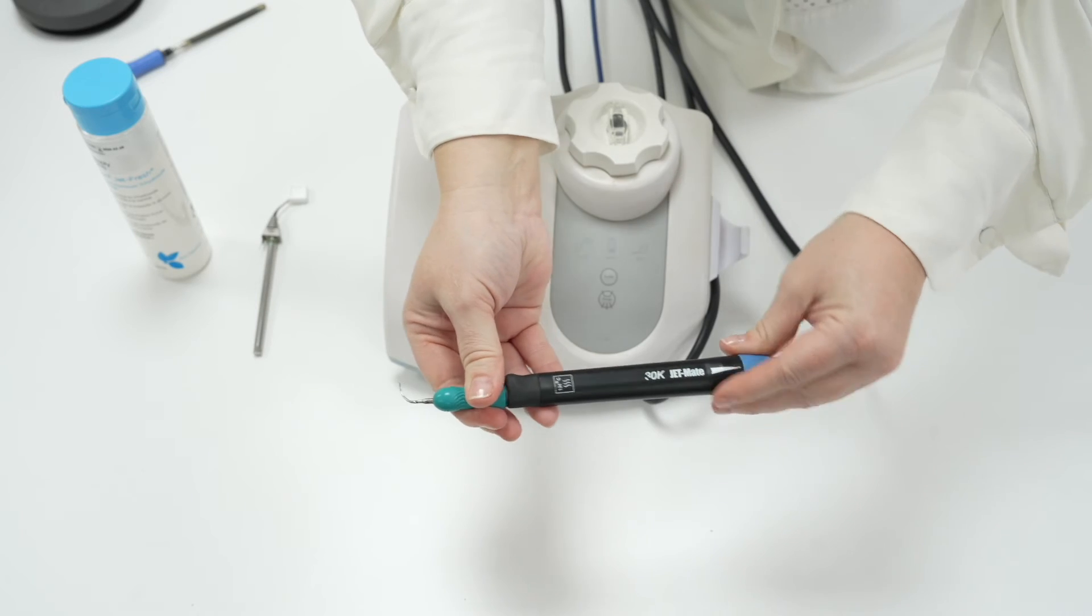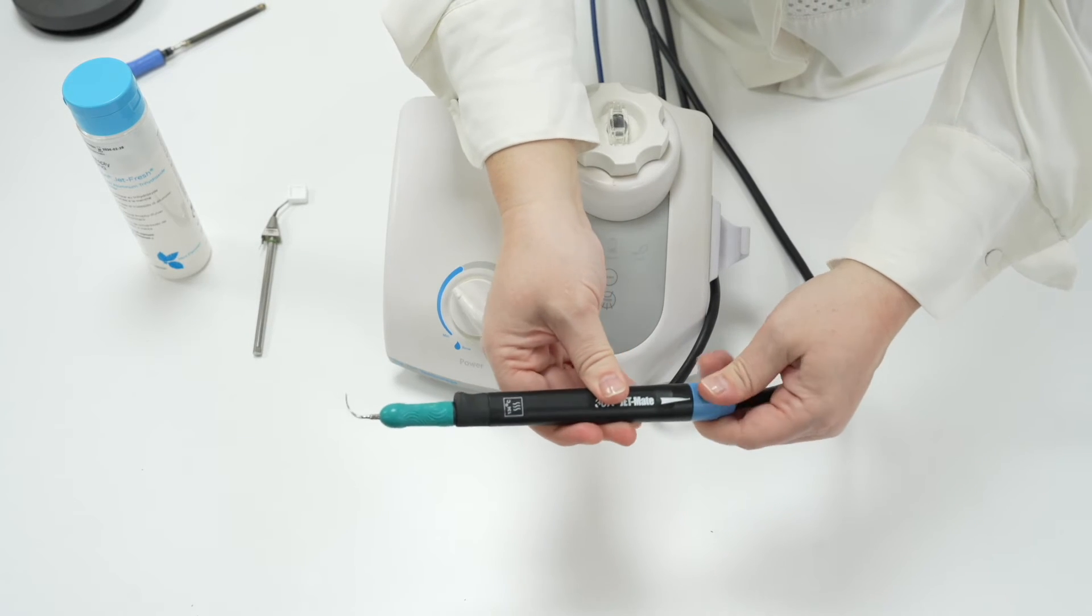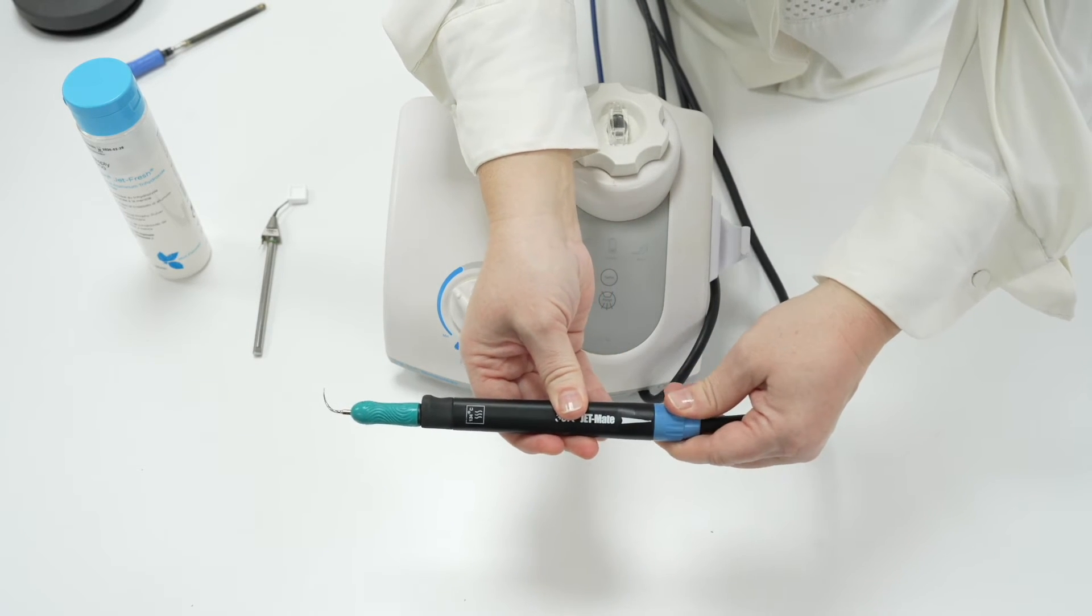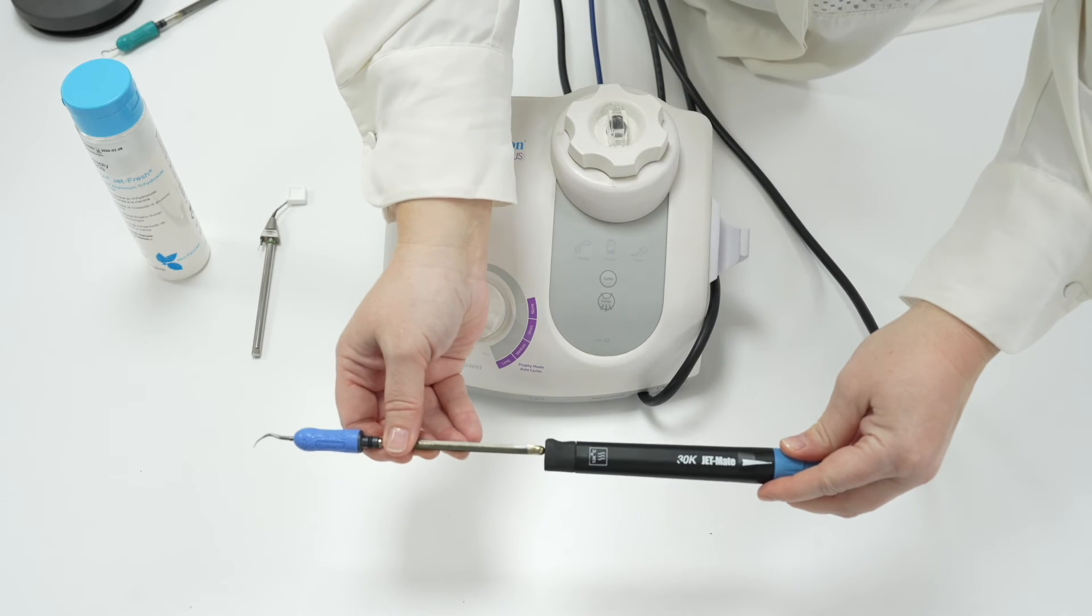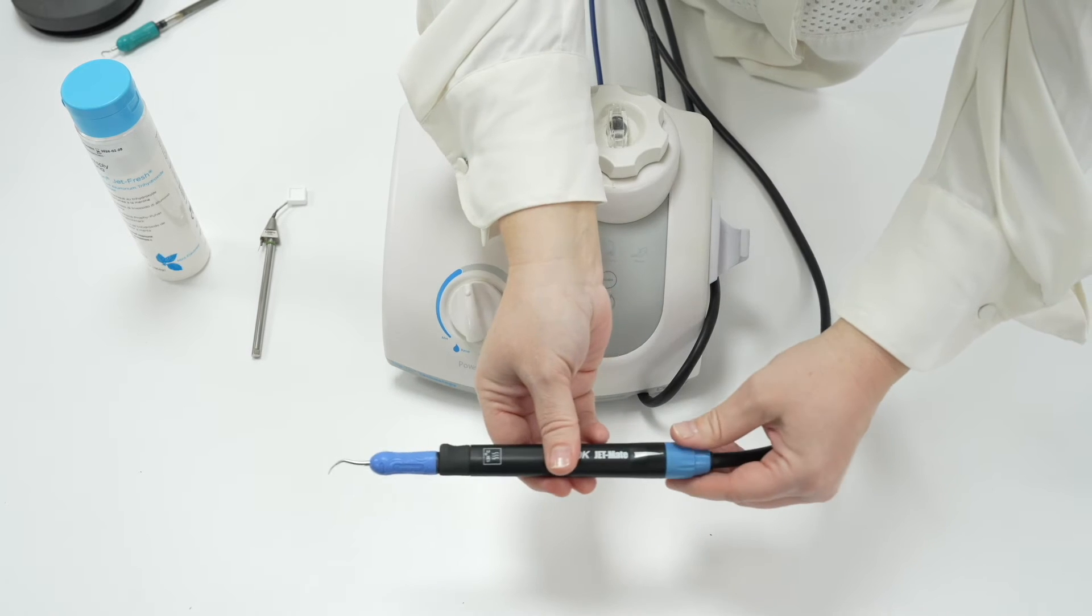Green subgingival periopocket inserts should be used on low power and water, keeping the dial in the blue zone. Blue inserts which are from light to heavy supragingival deposits should be used on medium to high power.